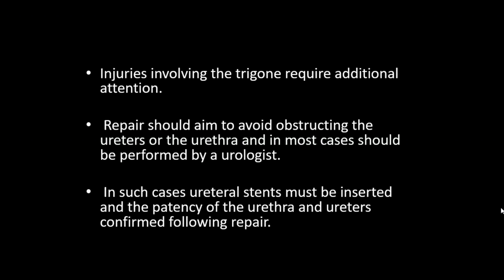And now questions appeared. Let's see. What is the value of preoperative imaging? Just to detect the ureters? Yes. Sometimes, Dr. Rana, the ureters have been markedly displaced far away from their normal course due to large fibroids, due to severe distorted adhesions of the pelvis with endometriosis, or cancer patients, actually. So it's very important to clarify the pathway of the ureters prior to getting inside the abdomen and doing your procedure, aiming to minimize the risk of ureteric injury. So this is ideal.